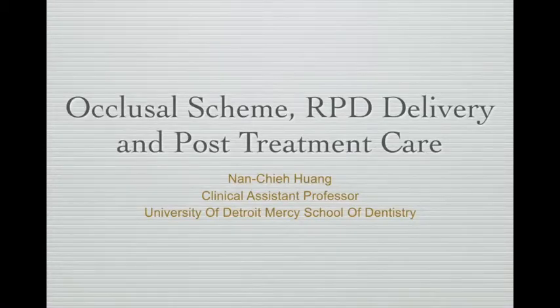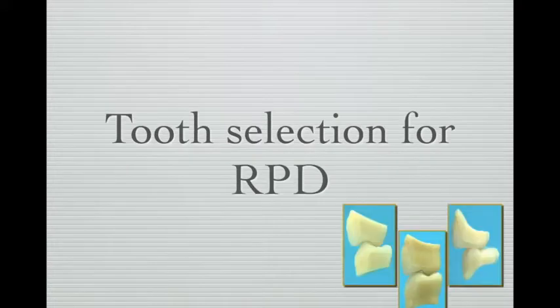Occlusal scheme, RPD delivery, and post-treatment care. So after we do a framework try-in, we are going to set up the teeth. When we set up the teeth, first of all, we have to determine what occlusal scheme we would like to provide.